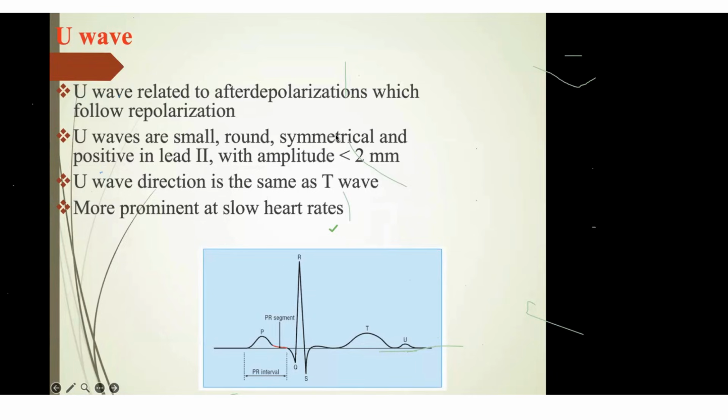So it is in the clinical context. But consider a 20-year-old lady in the OPD with anxiety, having tachycardia of 120. Usually it will not show any cardiac issues, but it may be thyroid illness, or some fever, or some anemia or something like that. So it's in the clinical context. Sinus tachycardia per se will not tell you anything.